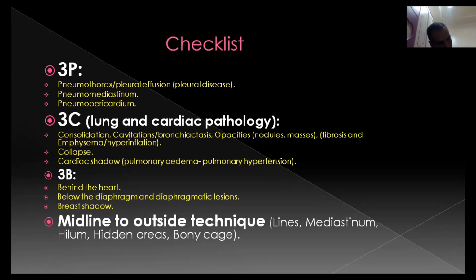Is it related to the patient's clinical situation, or may it take time? And the second thing, can you just give us a brief on the role of chest ultrasound in COVID also, because I think there is a role and people talk about this.